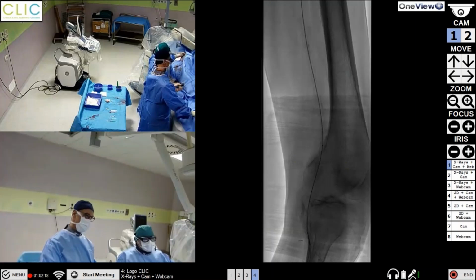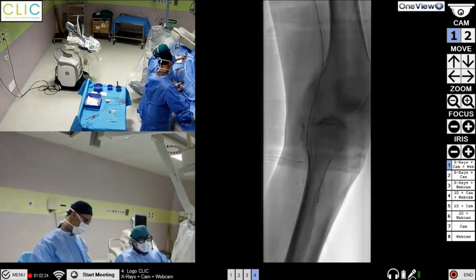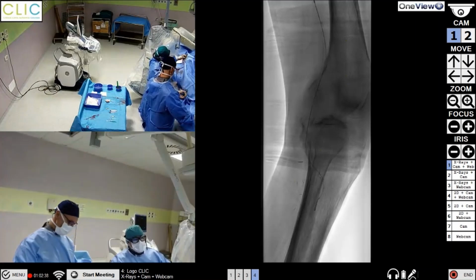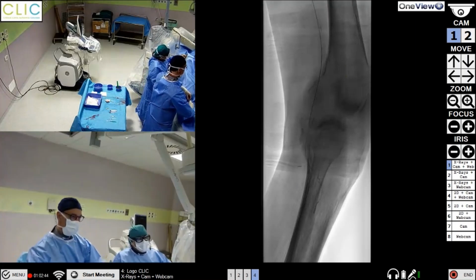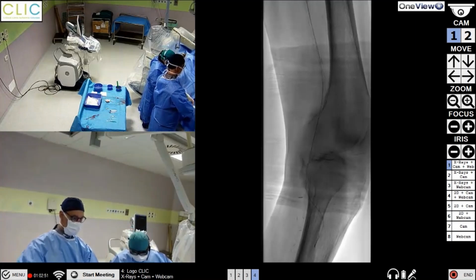I'm not sure if I have to try the anterior, prepare the anterior for an antegrade recanalization, or insist with the posterior and with the medial plantar artery. So I will check now, Enrico, hold the balloon. I will check now the aspect of SFA and POP, and then we check the foot all together, okay? Okay.